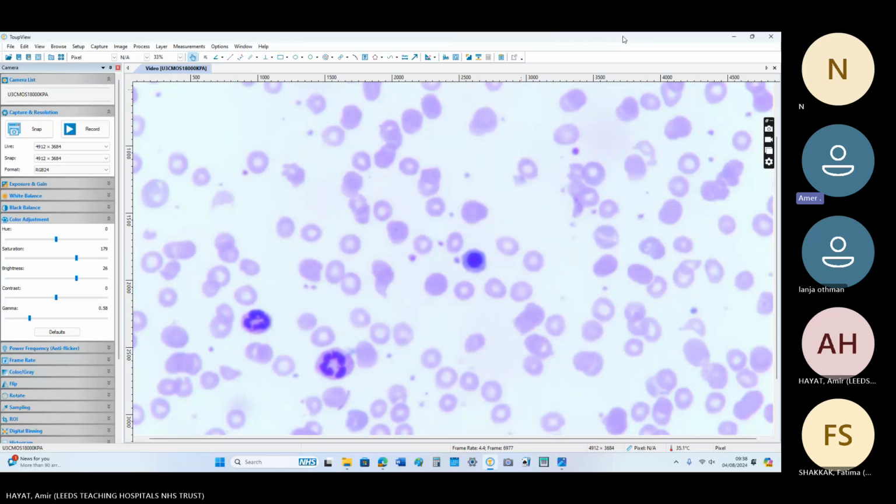The BMS called you because he has seen some abnormal cells in the blood film, and now you are the hematology registrar, and the film is with you.